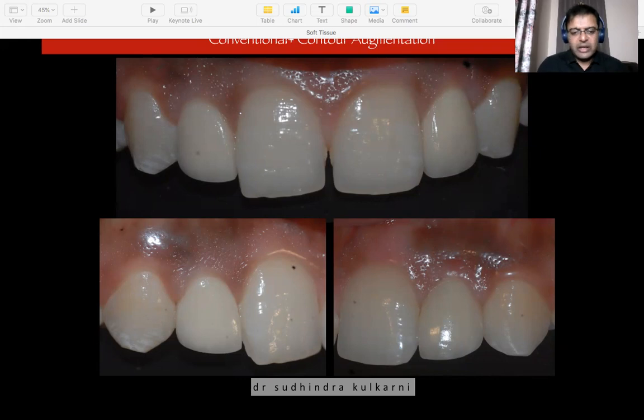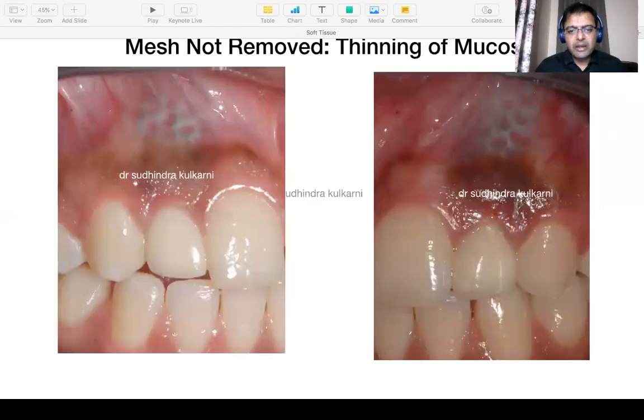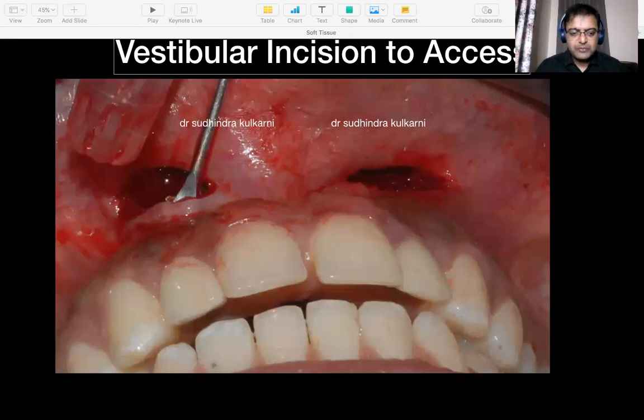What I had done was, when I was doing the implant placement along with simultaneous GBR, I used a titanium mesh. This girl comes back around 8 years after the graft. And when I see her 8 years down the line, you see that in the areas where I have the titanium mesh, the mucosa started thinning down. And because of this thinning of the mucosa, now I'm scared it would just perforate out. So before it perforates, I wanted to open up and take out those titanium meshes.